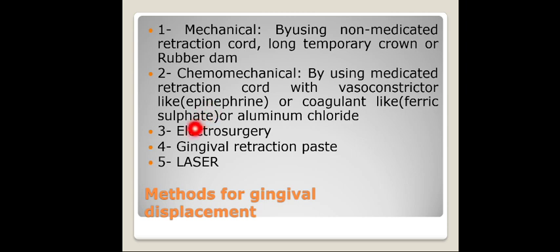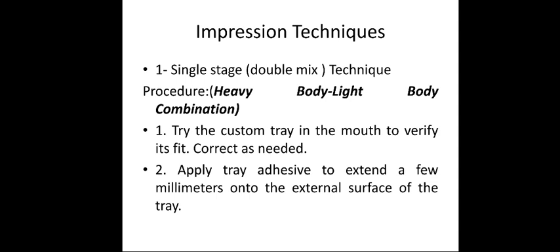Sometimes we can reflect the gingiva by electrosurgery. Sometimes laser is done. Sometimes by gingival retraction paste. The impression techniques are divided into two main techniques, which are the single stage and the two stage.